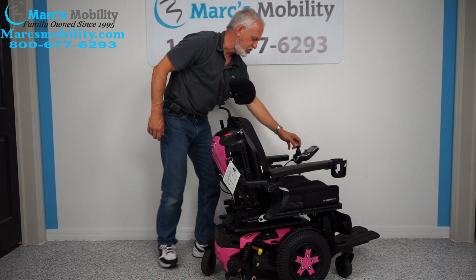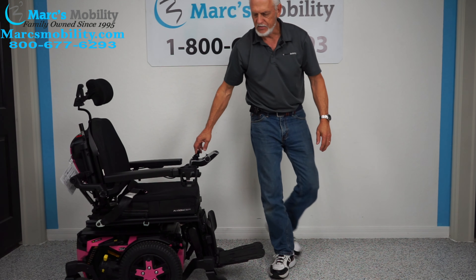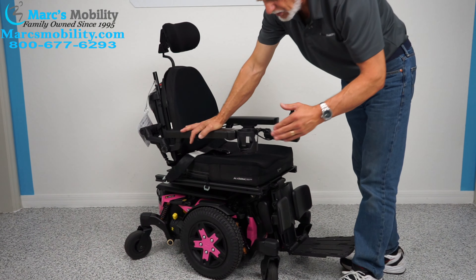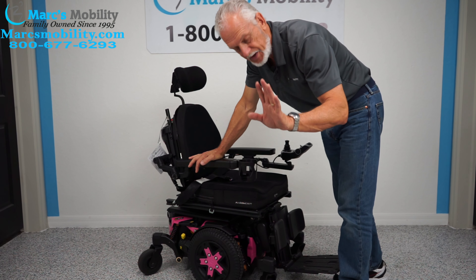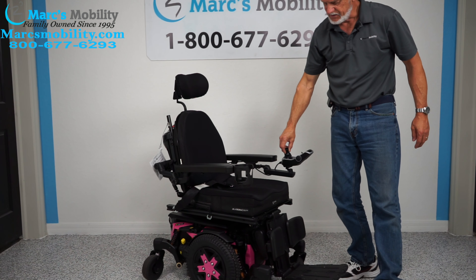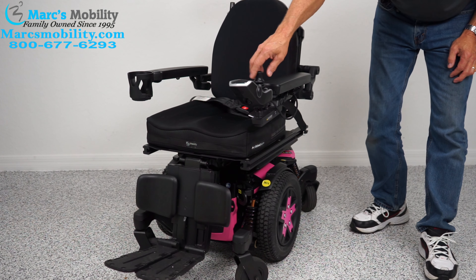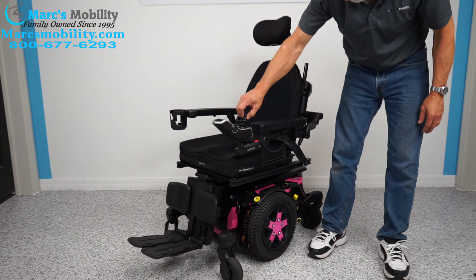There are lights on this chair — lights on the fender here and here. They forgot to install the on/off buttons, but we will install that. You will have headlights and taillights on the fenders. It has LED lights in the front and LED lights in the back, and the on/off switch will be on there when you get the chair.